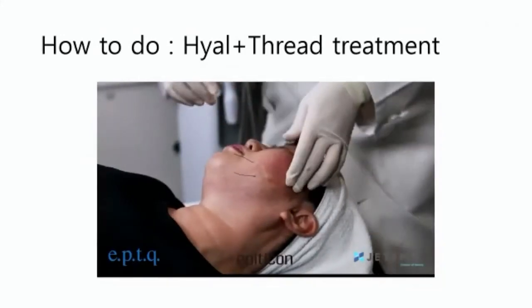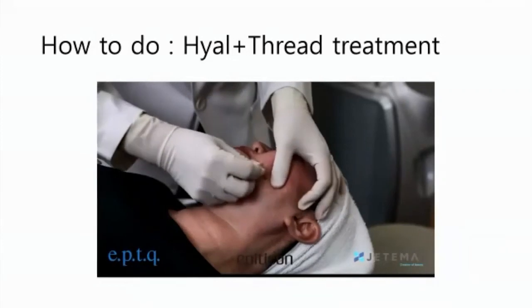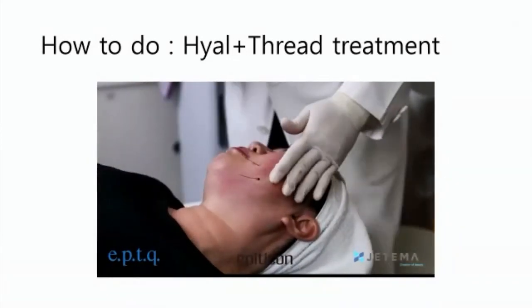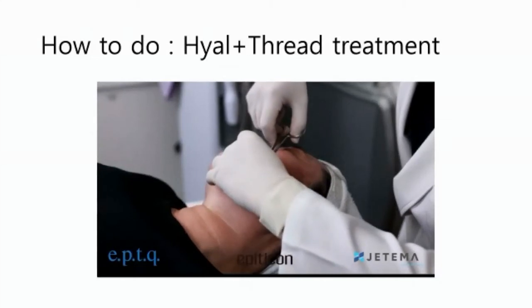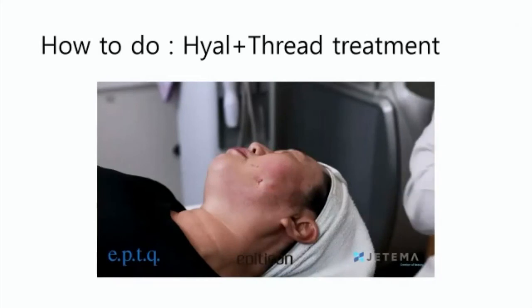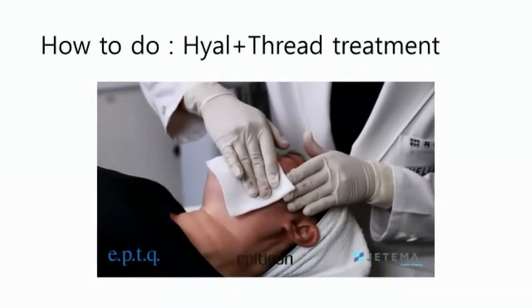So in my case, I use only 2 or 3 threads for the marionette line treatment. Cutting and loosening the insertion part.